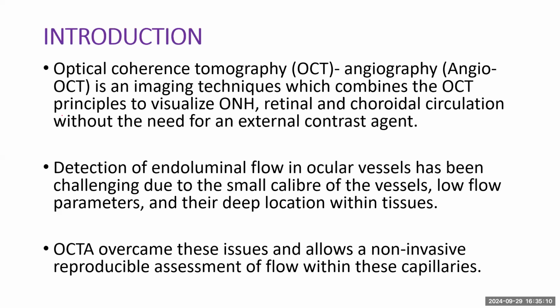That cascaded into different forms of imaging, notably angiography with dyes and different contrasts, then Doppler systems, and even some OCTs that have Doppler systems.